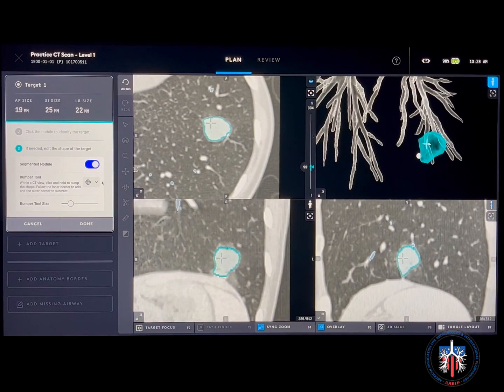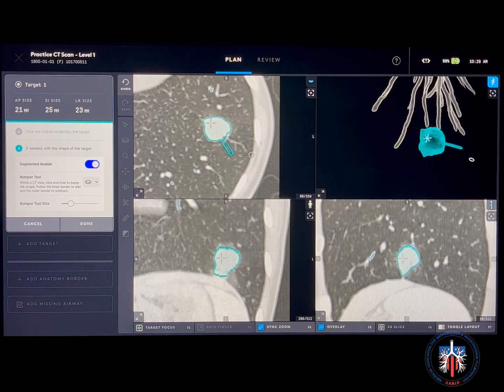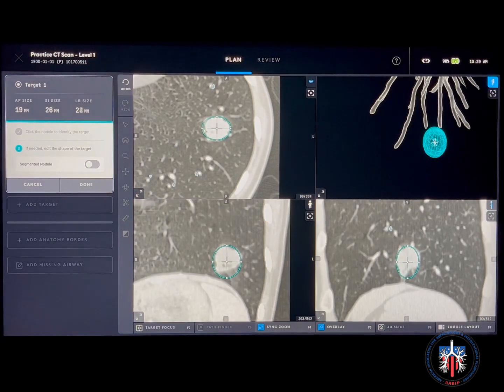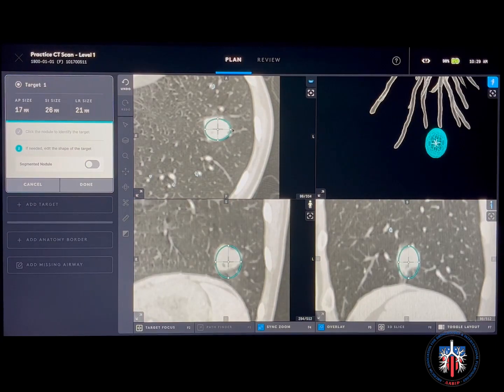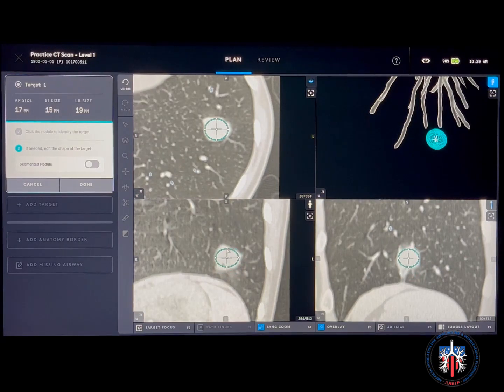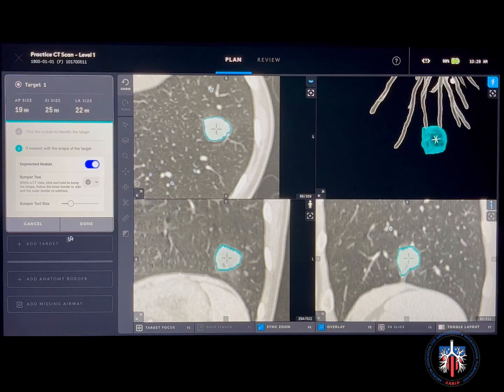You can also select the single slice bumper to increase or decrease the nodule size on a single slice only. If the nodular opacity is not well defined and cannot be segmented, you can create an ellipsoid target that can be modified to fit the desired surface. In our case, we will revert back to the segmented nodule option.